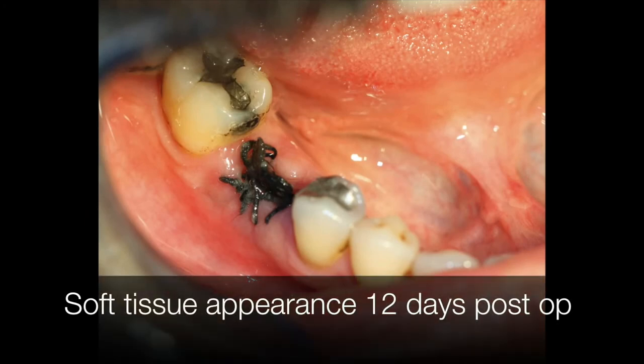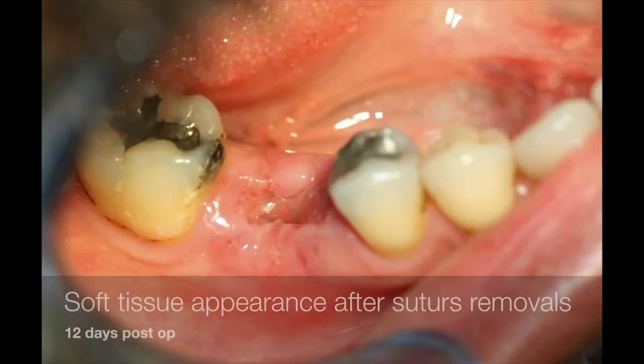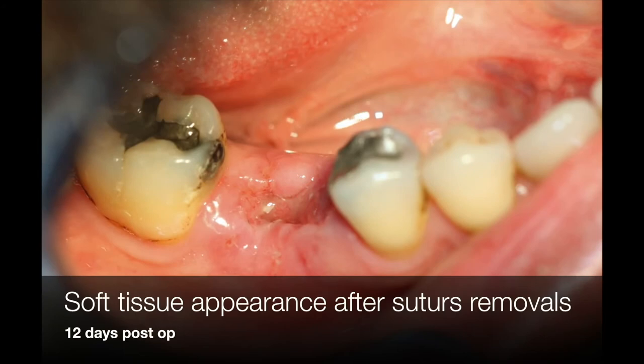After 12 days, you can see the suture inside, and during the removal of the suture we can see that beneath there is the proliferation of the soft tissue above the graft.